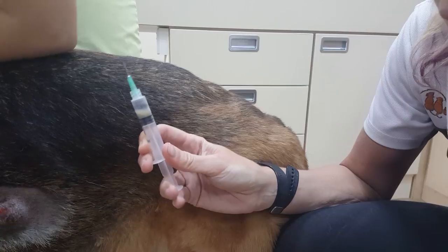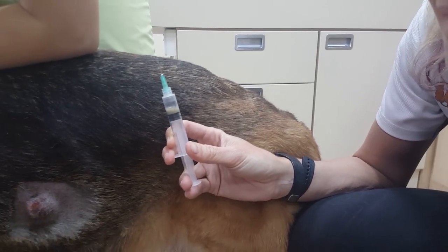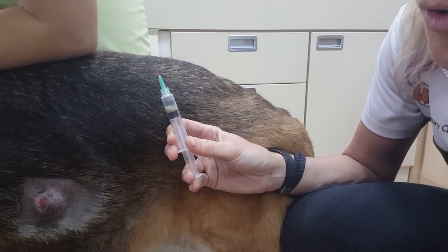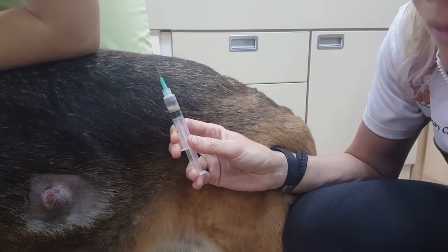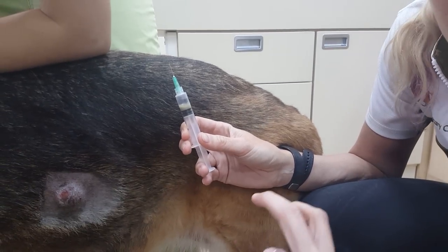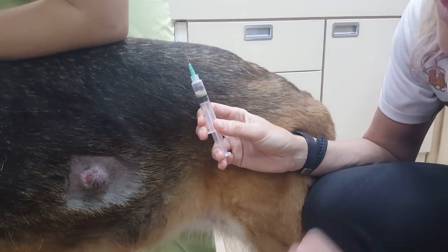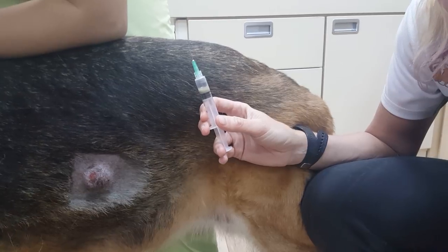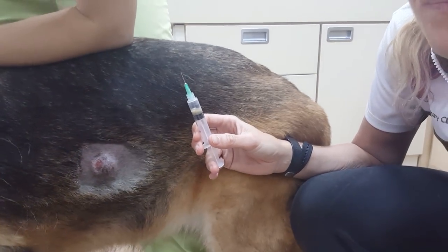I'd be very suspicious that this is an infected cyst, or we might have a little type of tumor underneath that. So we'll take a look at the cells and we can figure out from there what we need to do.